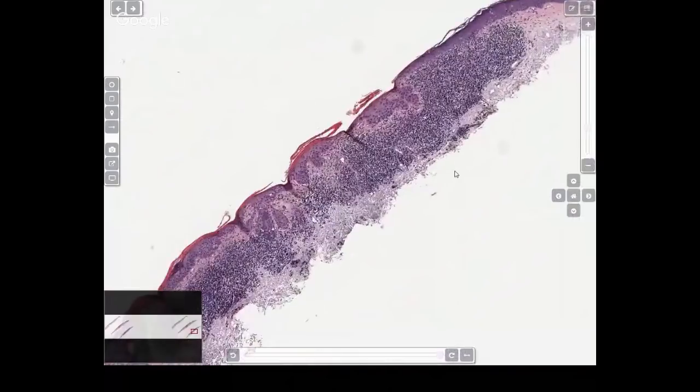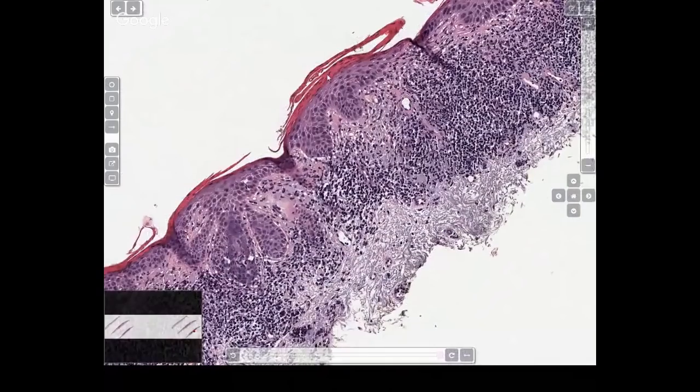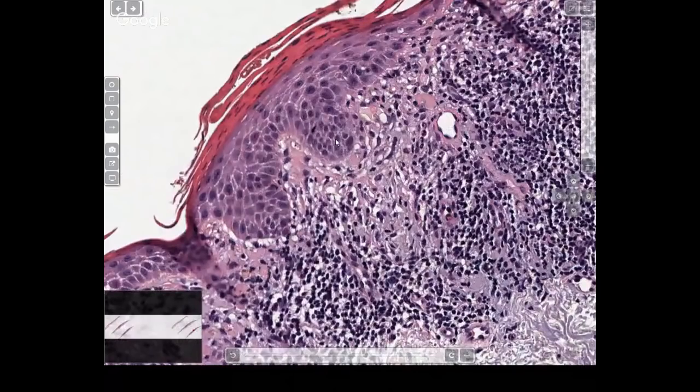actinic keratosis that is known as lichenoid actinic keratosis. And always they tend to have parakeratosis on the top, because most cases of actinic keratosis are going to show you parakeratosis on the top. So there's parakeratosis on the top, a lichenoid infiltrate, and basal layer atypia.